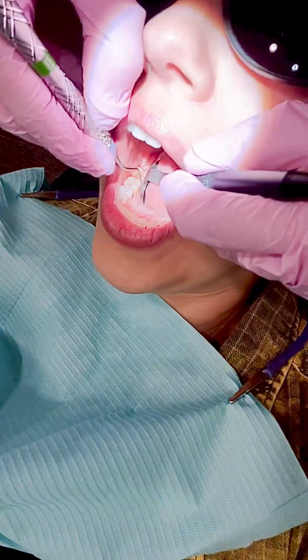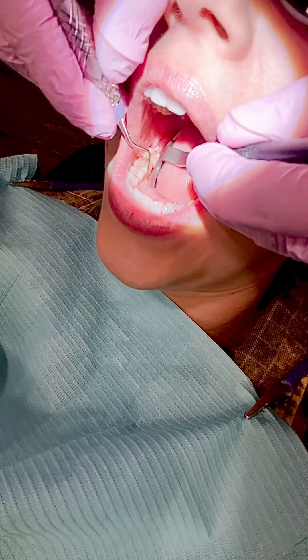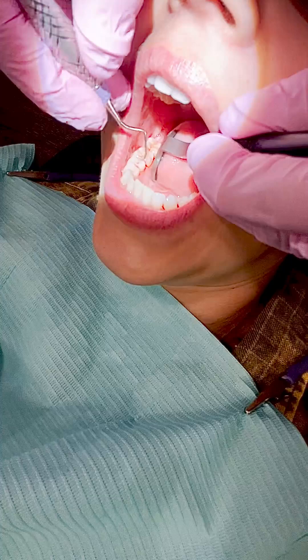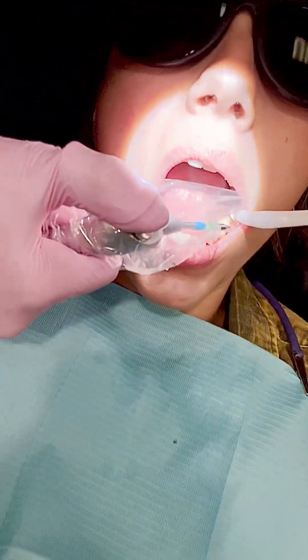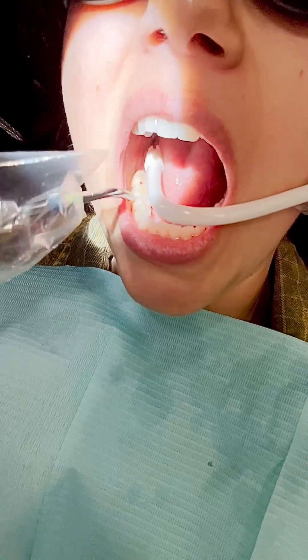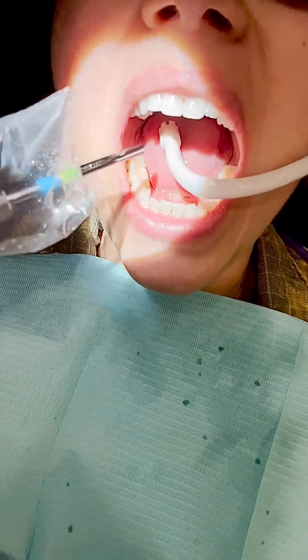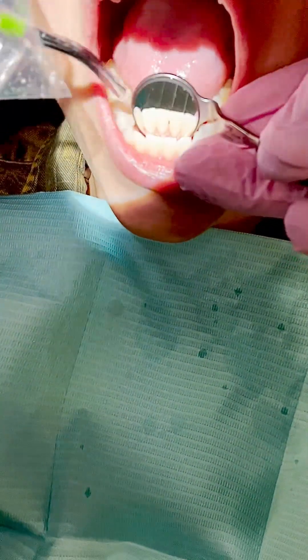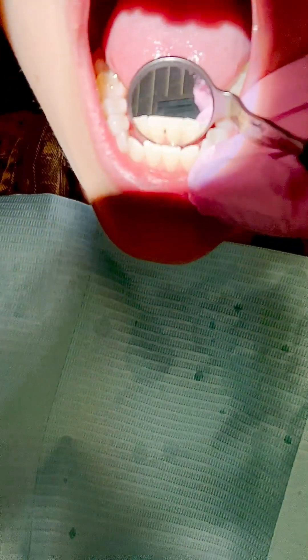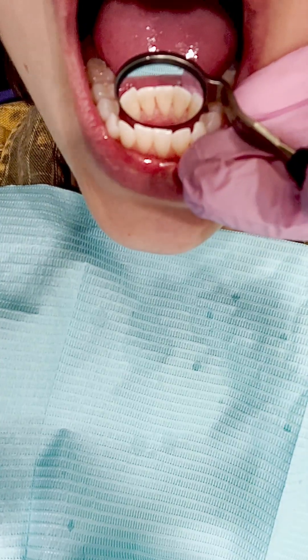Now I'm using my fulcrum fingers on the buccal cheek, getting into these areas. I'm going to switch back to my nevi because the nevi is what I use for super tight contacts that have a lot of interproximal buildup. The nevi is really sharp — it's a thinner instrument to really get in there. Now I'm going to blow air and check that I got everything after cavitroning, and see where on the lower anterior teeth I still need to get.